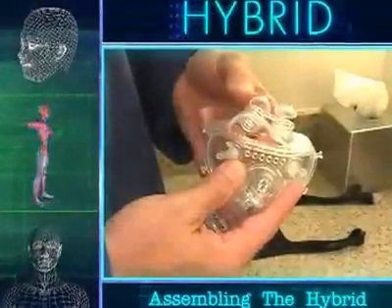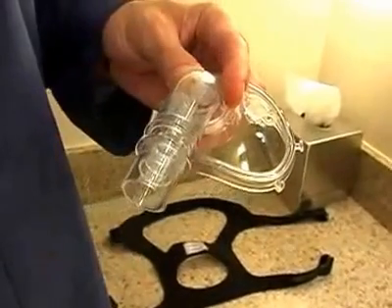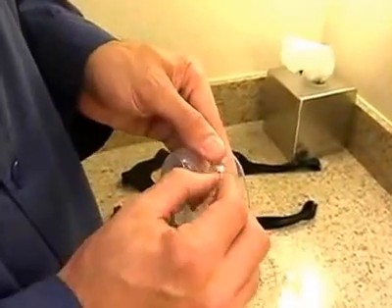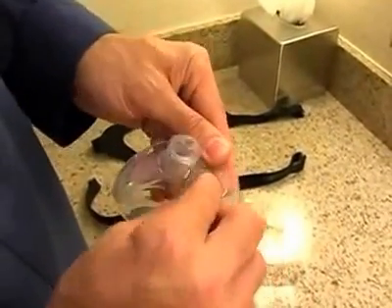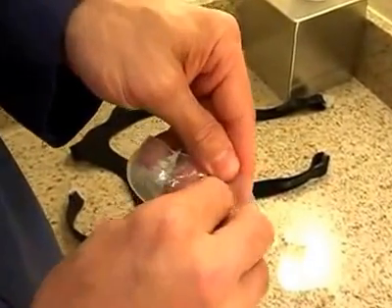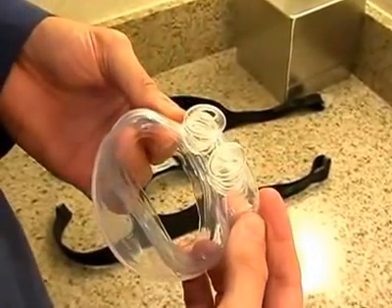Please follow these steps to assemble the Hybrid Interface. Attach the swivel coupling to the shell elbow. Insert the nasal pillows into the oral cushion and adjust the pillow height to the appropriate position. Note that the silicone bar joining the pillows should lie horizontally between the pillow openings in the cushion and away from your face.